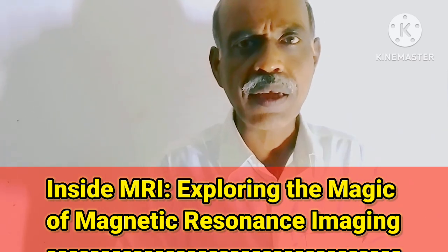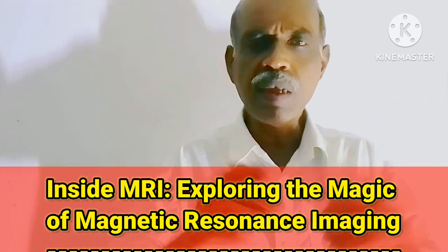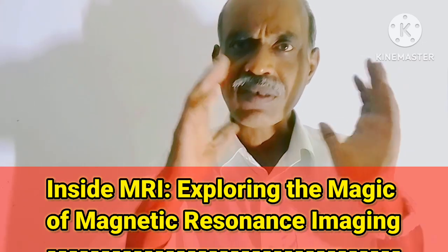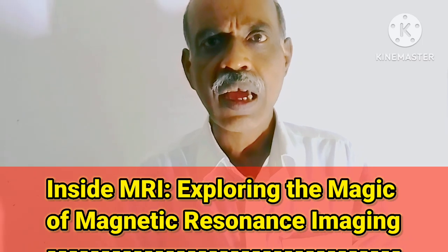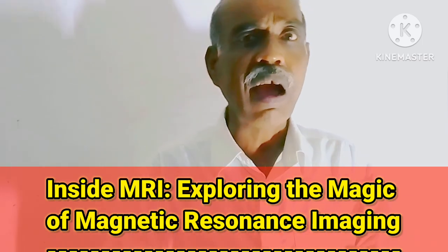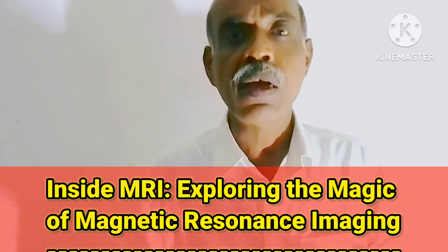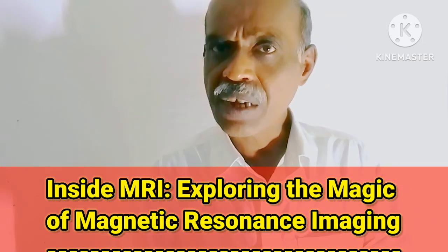Noise is coming from outside, please ignore that noise. Anyway, for some time a magnetic field is applied to the patient's body, and along with that, RF signals. RF means radio frequency pulses, which are sent for some time.